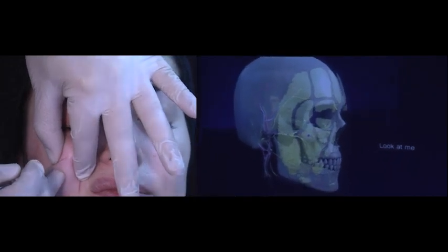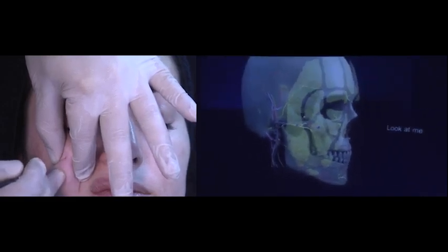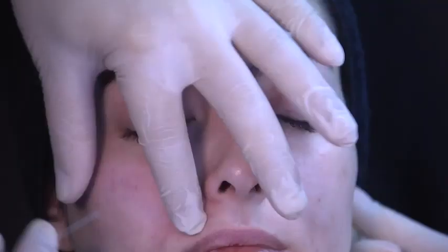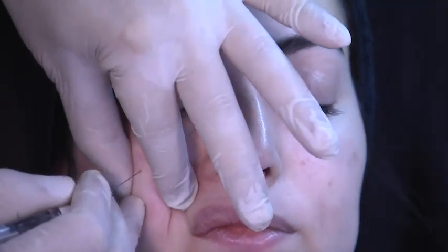Entry point. If we see the nerves now, I'm going to put the nerves, they travel along the same trajectory as the vessels. So the nerves are really not an issue here with the treatment. Remember, it's a treatment not to provide volume, it's a treatment to provide lifting. That's why we have this tower technique. We're trying to do isolated points, not to volumize and have lateral projection.